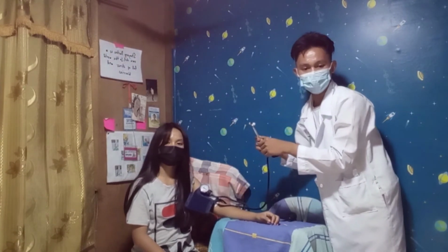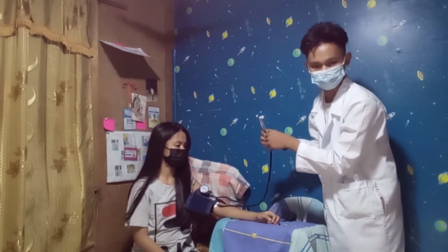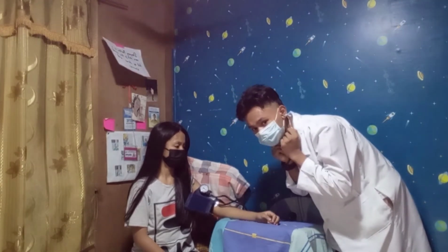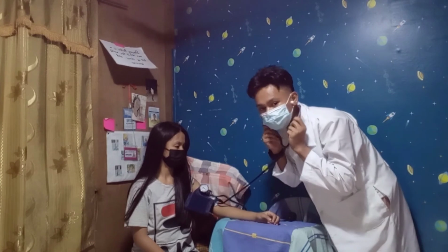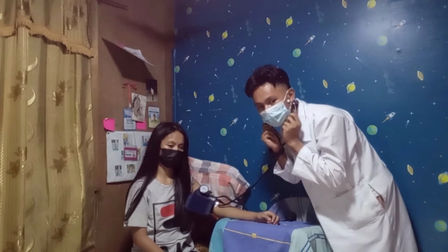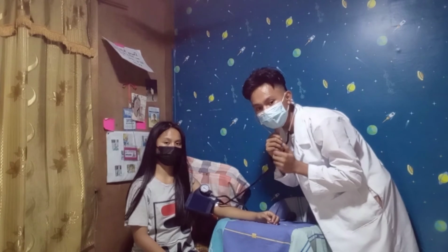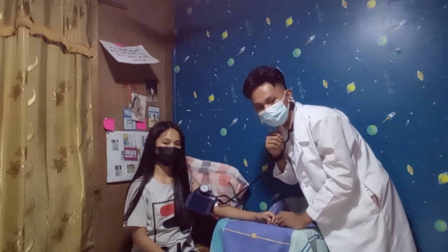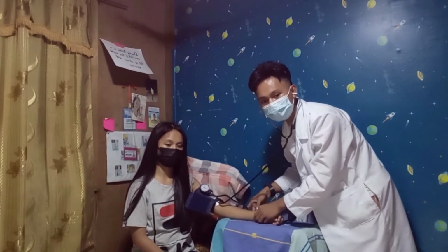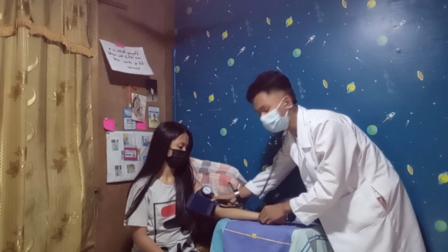Insert the earpieces of the stethoscope in your ears so that they tilt slightly forward. Be sure sounds are clear, not muffled. Ensure that the stethoscope hangs freely and does not contact any object. Warm the diaphragm of the stethoscope, locate the brachial artery, and place the diaphragm over the brachial fold. Secure the chest piece by placing the non-dominant hand over it.